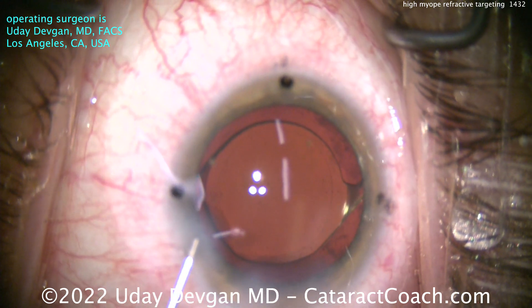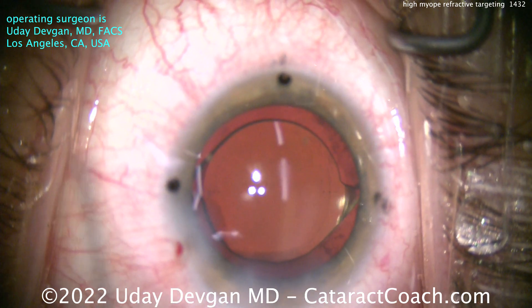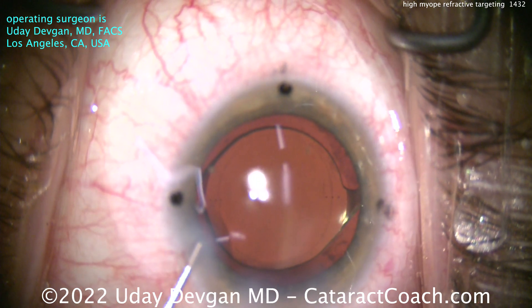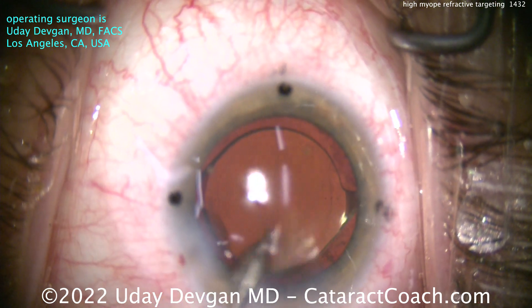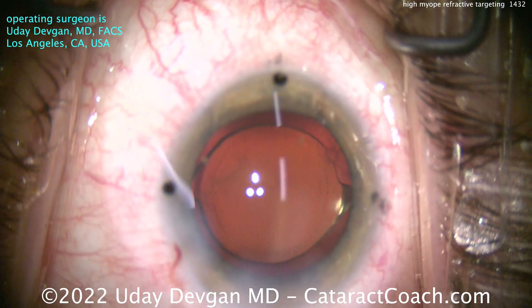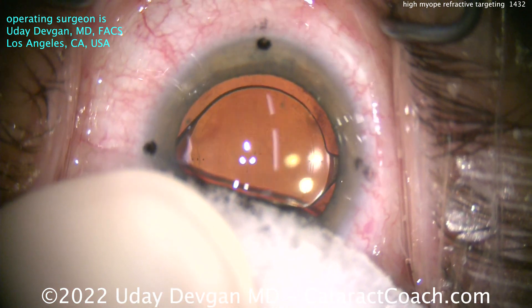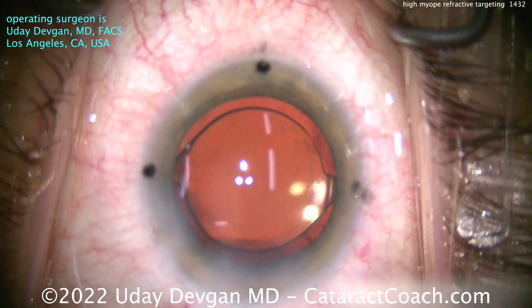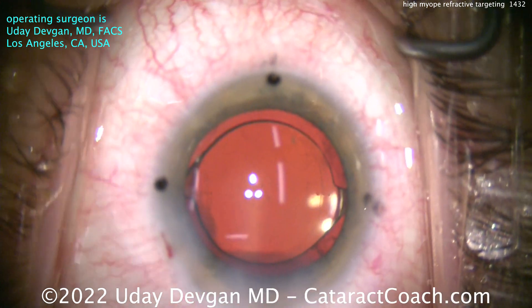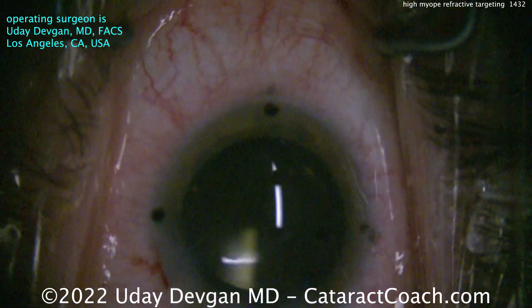I encourage you — if you're doing cataract surgery in someone who's ultra-myopic, this patient got a six-diopter lens — keep that in mind. If the patient is this myopic, really don't aim for plano. We don't have the accuracy to predict that with our power estimations and calculations. And these patients actually appreciate a little myopia. Thank you.